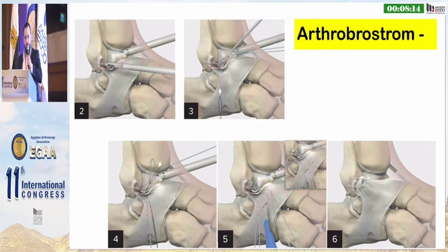Using the normal anteromedial and anterolateral portals, we debride the footprint of the ligament and the lateral gutter. We drill the tunnel for the anchor 1 centimeter above the tip of the fibula. We pass the anchor. We use a suture passer, suture lasso, and go inside out in the markers we made before. A wire loop we introduce and grab the suture.